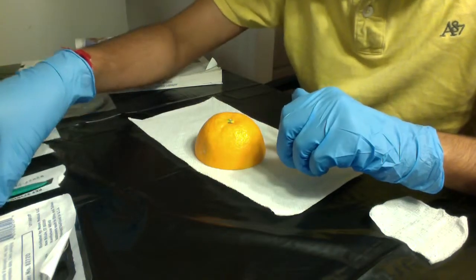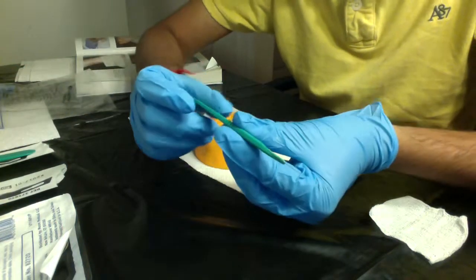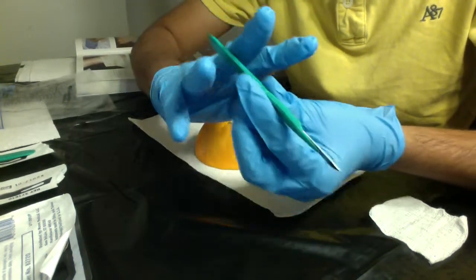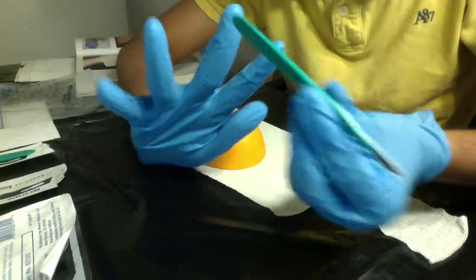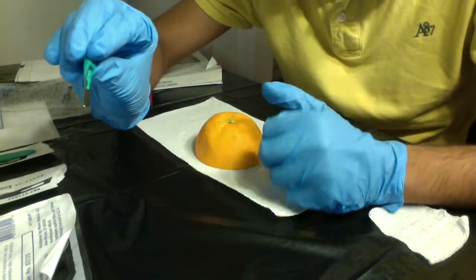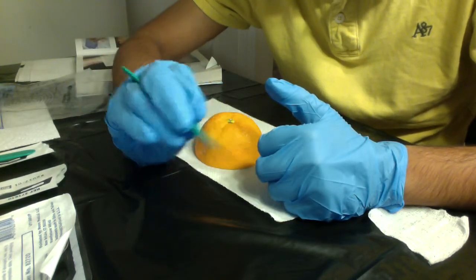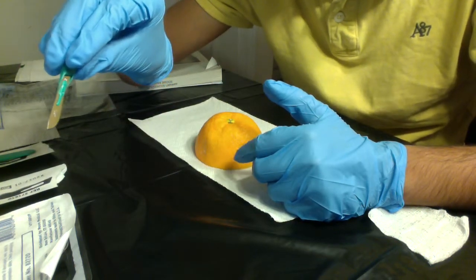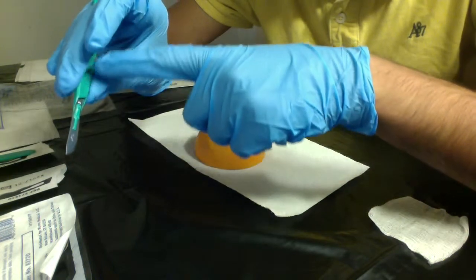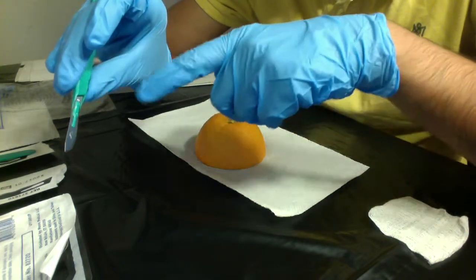The technique involves using the scalpel blade number 10. I'm using the third web space, and my fingers are curling around the scalpel margins right at the junction of the scalpel blade and the shaft of the scalpel.